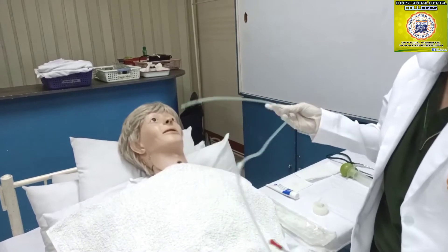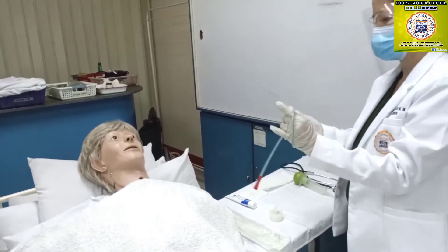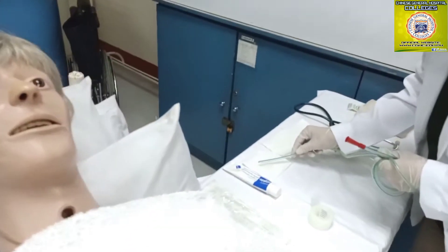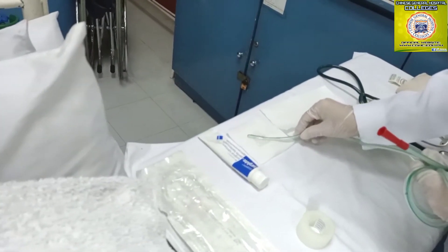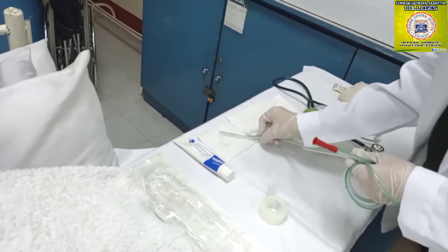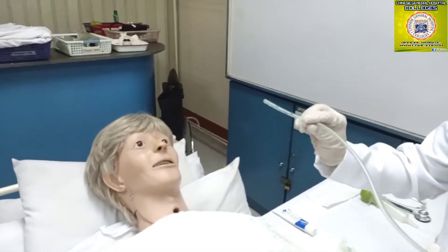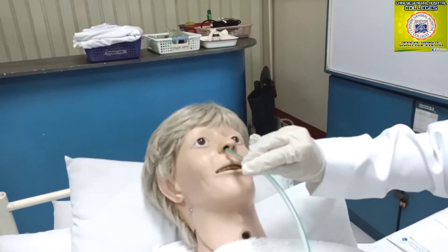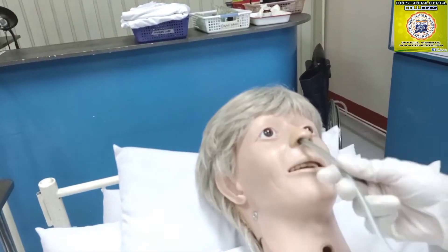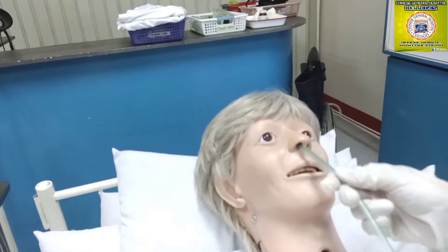Lubricate the tip of the tube about 3 inches. Insert the tube into the client's nostril, directing the tube downward and backward until the nasopharynx is reached.